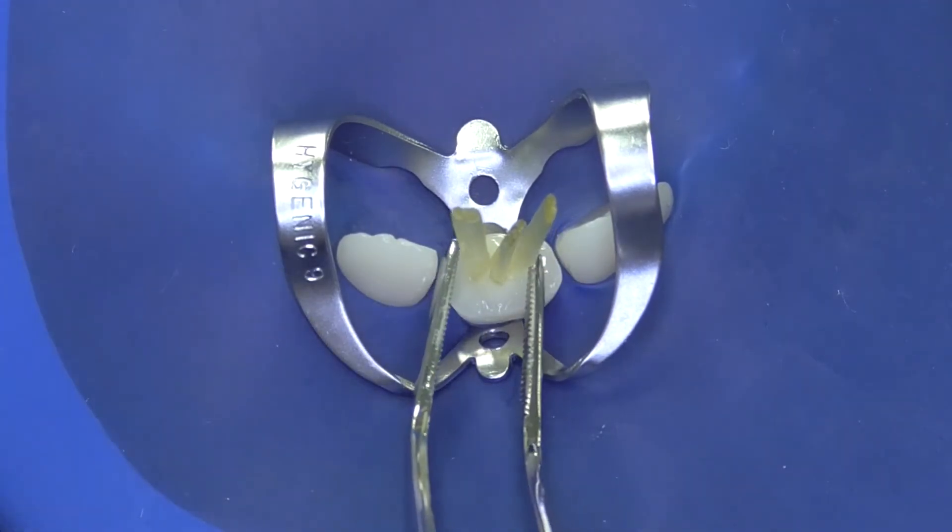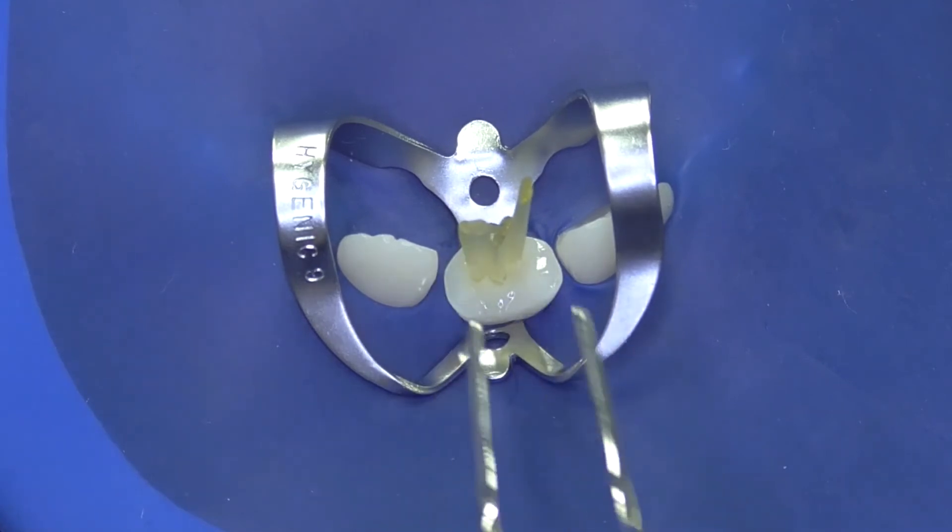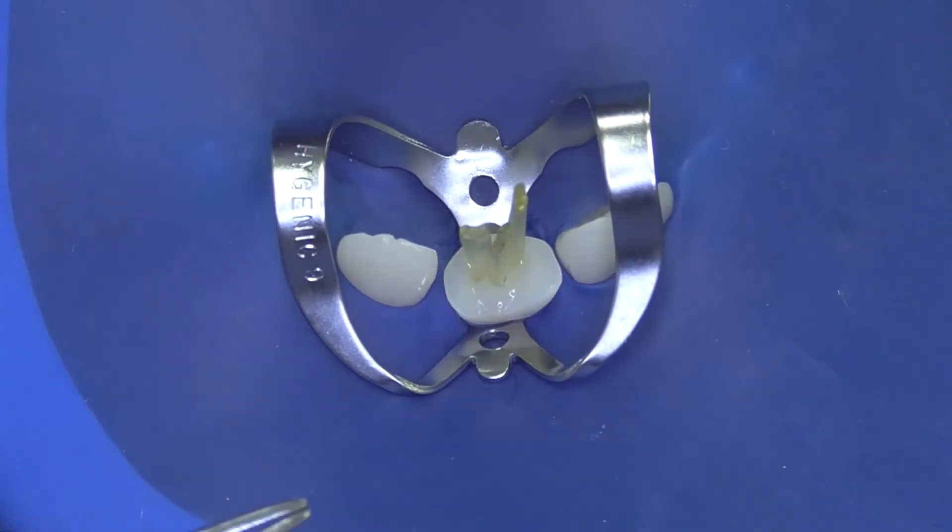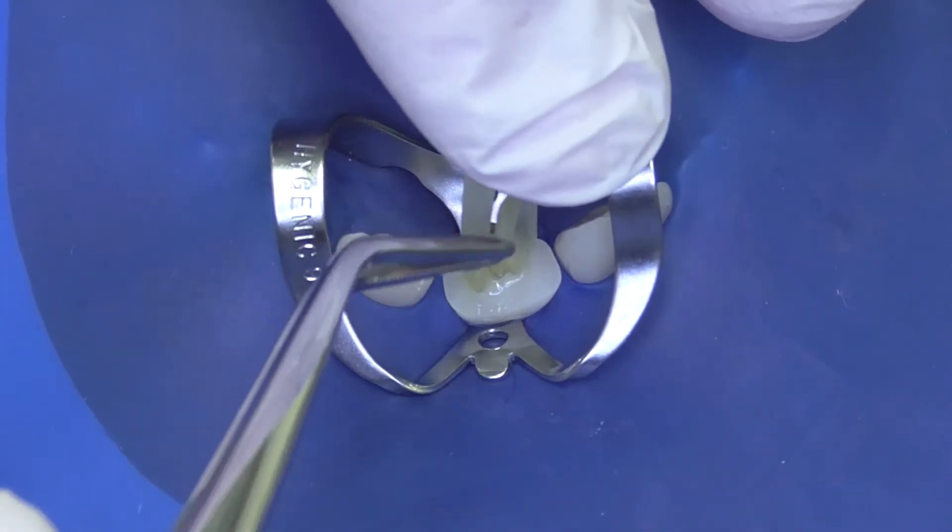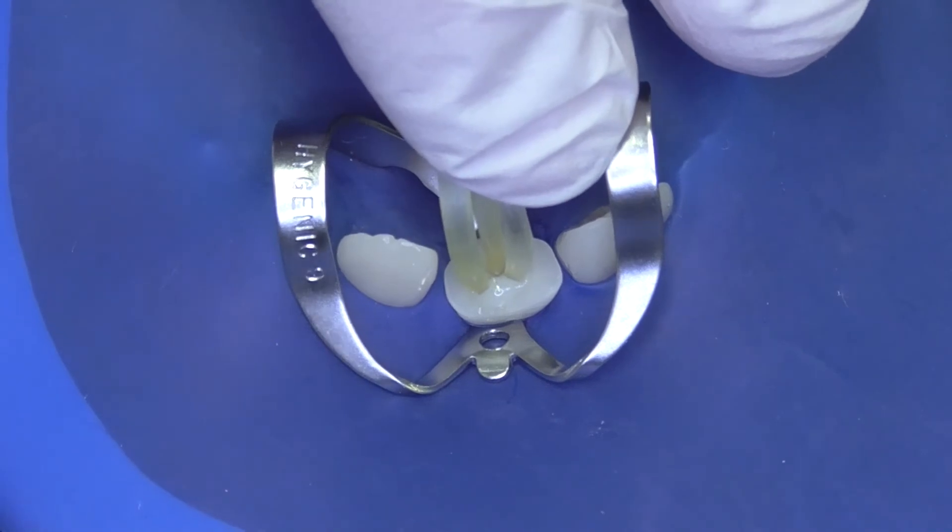Angulation can be made like we are doing it here, and then the initial curing of the cement and the post will be made by our curing device.